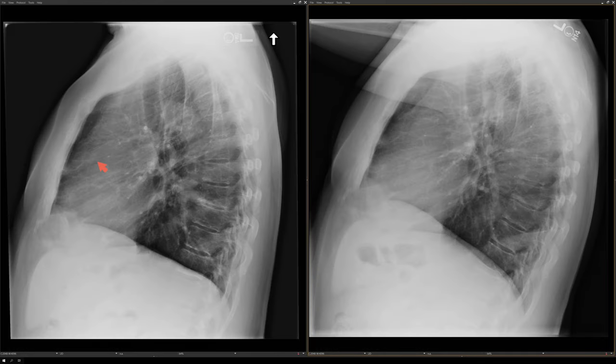Let's take a look at the lateral view. On the lateral view, you can see that area of reticulation right here in the upper lung, and you can see the elongated opacity here behind the heart.